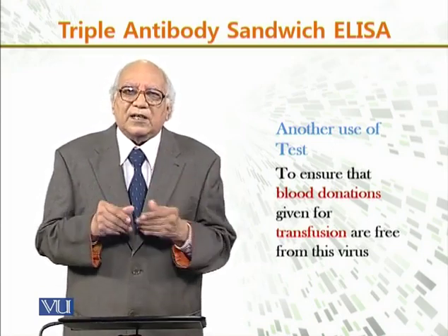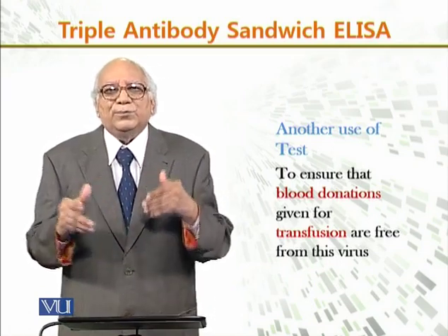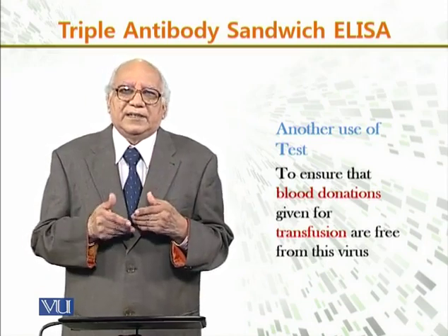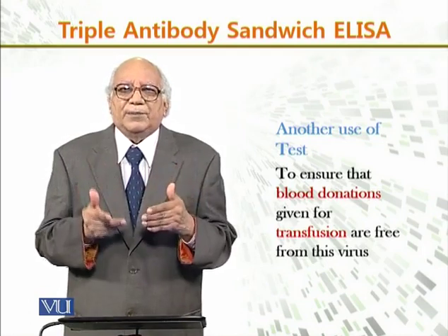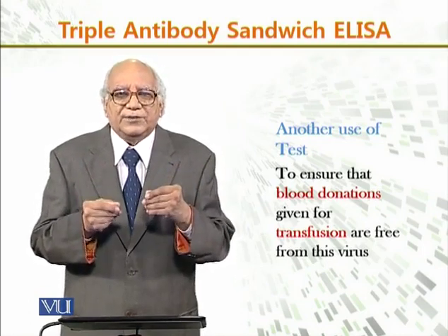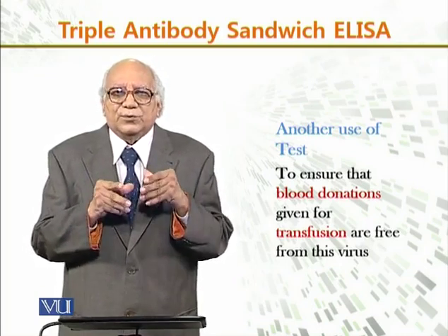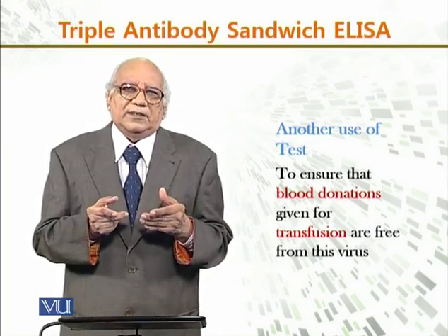Indirect ELISA is also very useful for blood bank establishments, to check whether the blood which is donated for further use is free from HBV or not.